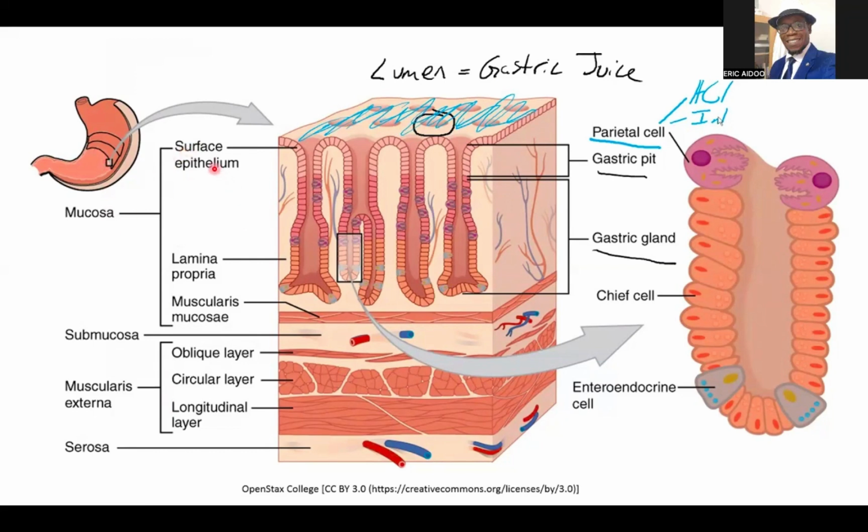That is taken from a portion of the stomach. That is the mucosa made up of the surface epithelium. So you can see the simple columnar cells coming down in the form of the pit, and then forming the glandular portion and then rising. And that is the lamina propria. You can see that the lamina propria also forms a solid core of the mucosa that is rising up. So when the epithelium goes up, the lamina propria goes with it. So we say that that's a mucosal fold.